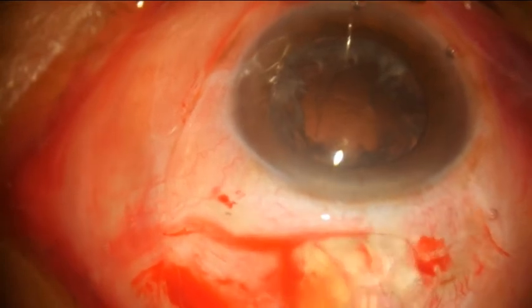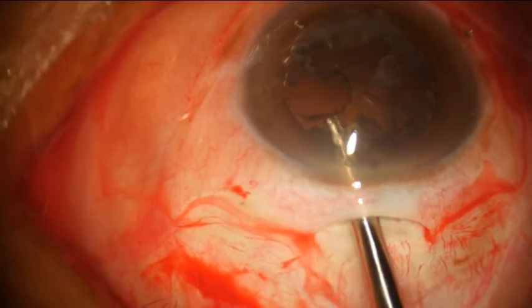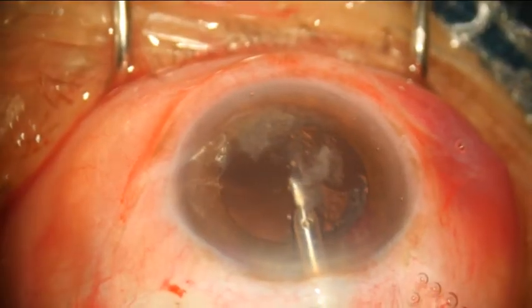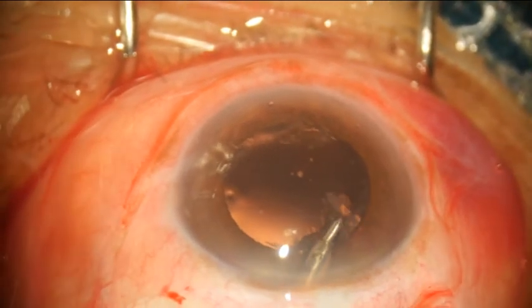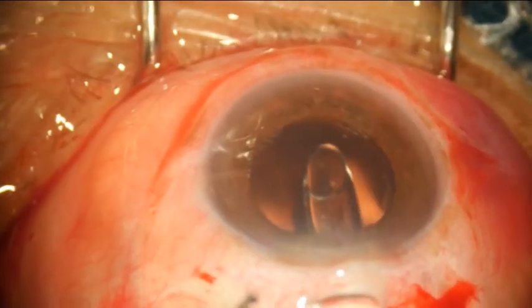After initial irrigation, I use the Muskati cannula, which has an aspiration port at the tip and three openings on the outer part for irrigation to occur. It sucks the material quite nicely, including at the 12 o'clock position, so you get most of the cortex out.